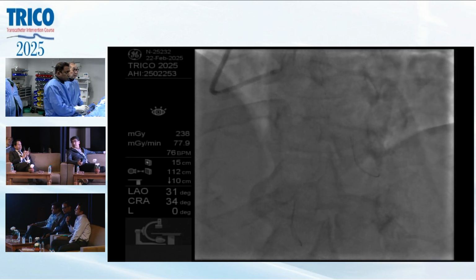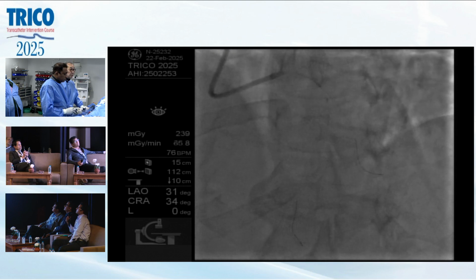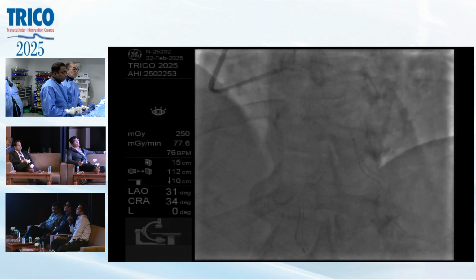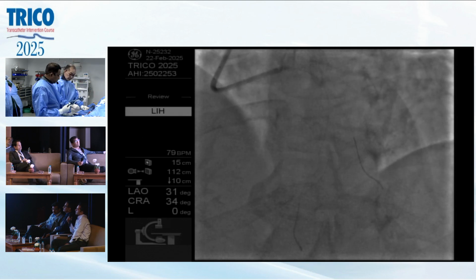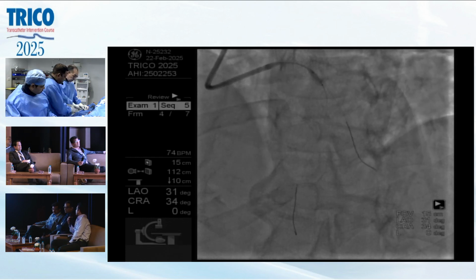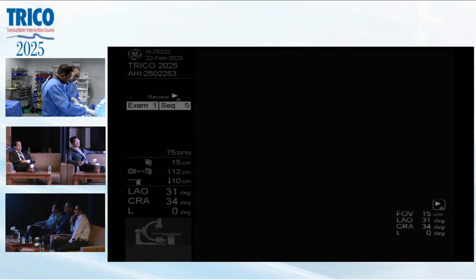I'm planning to do a two-stent technique. I think this vessel, the side branch, is very big, very important. The criteria I use for two stents versus one stent: one is the length of the lesion in the side branch being more than 10 millimeters. In this situation, it's not. Another is using the DEFINITION criteria, which we did before. A complex lesion needs a complex strategy.